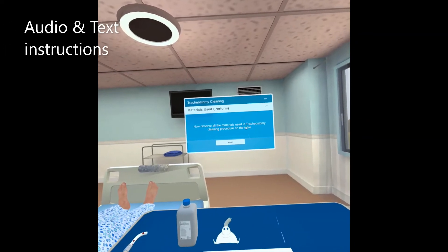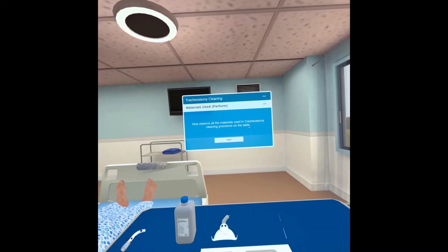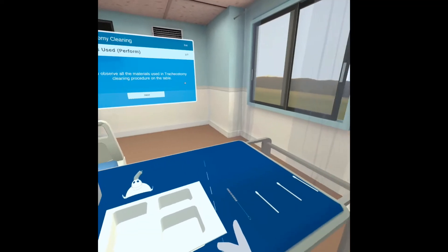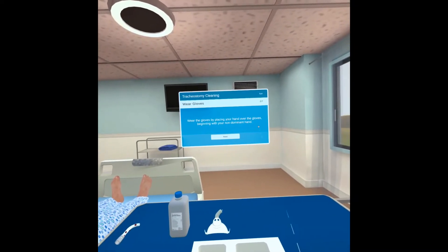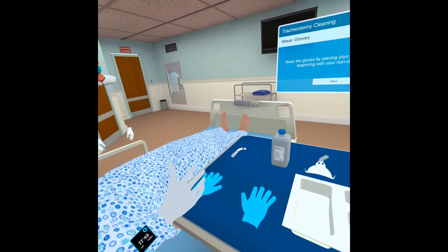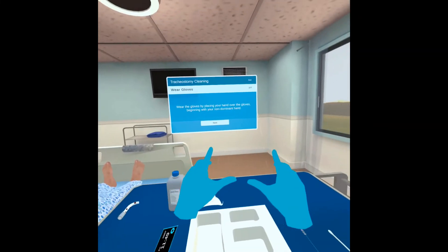Now observe all the materials used in the tracheostomy cleaning procedure on the table. When ready, click on the next button. Wear the gloves by placing your hand over the gloves, beginning with your non-dominant hand. When ready, click on the next button.